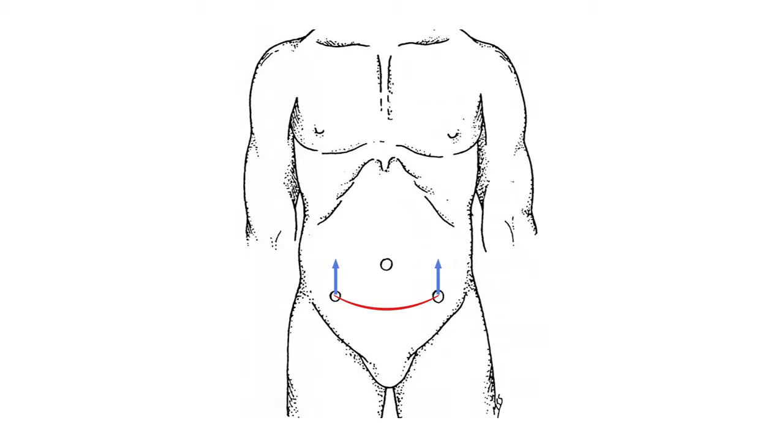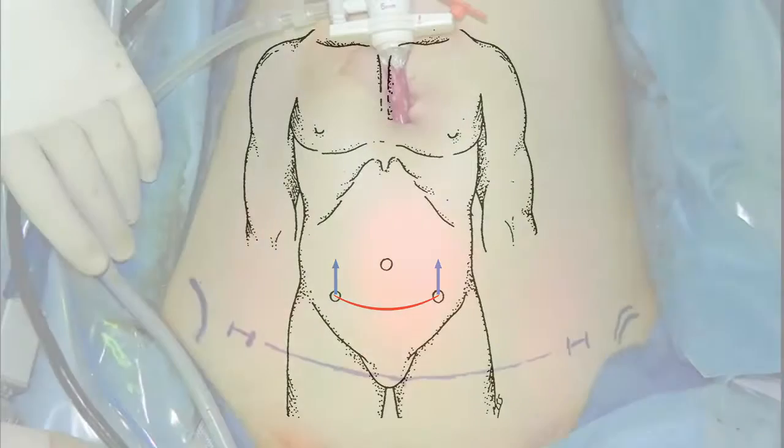After low Pfannenstiel port placement, the 8mm working ports can be easily translated superiorly due to the relative laxity of the pediatric abdominal wall. HYDES port placement is also feasible in infants, as they have sufficient abdominal laxity to superiorly translate the lateral ports after placement, such that lack of working space is not a limitation.